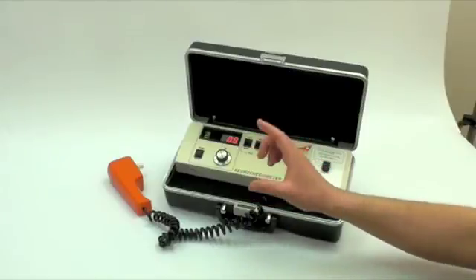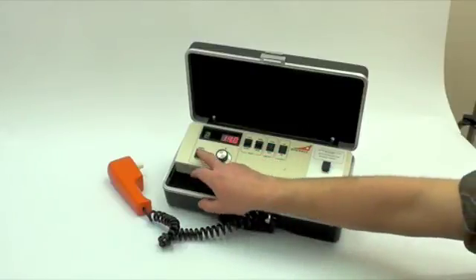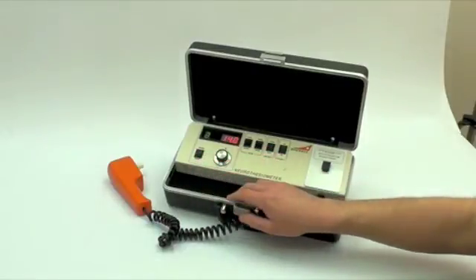You do the next site, rest it up against the patient's foot, turn it up until the patient says they can feel it. To store that recording, you press that button again.